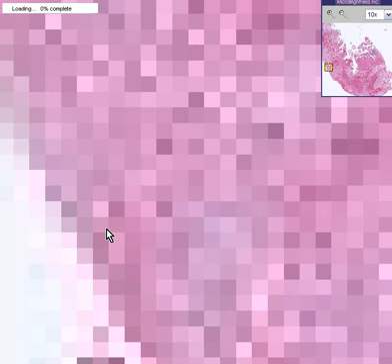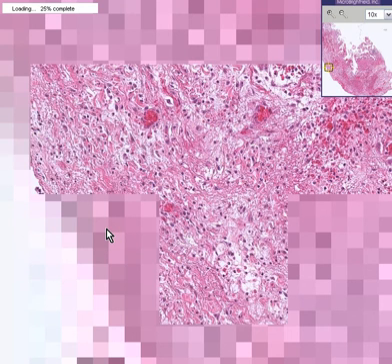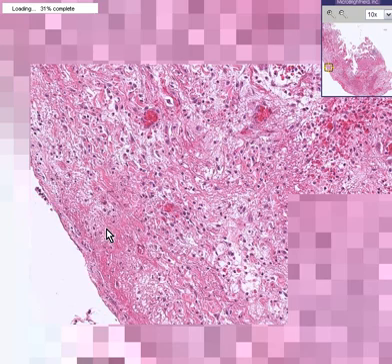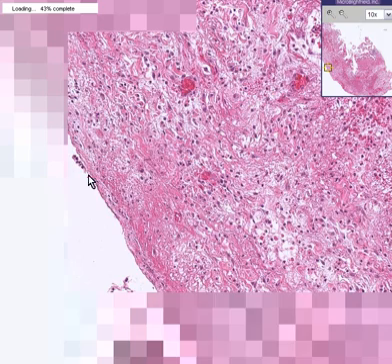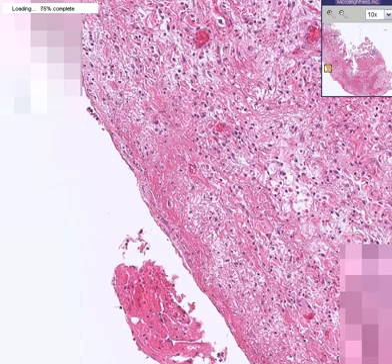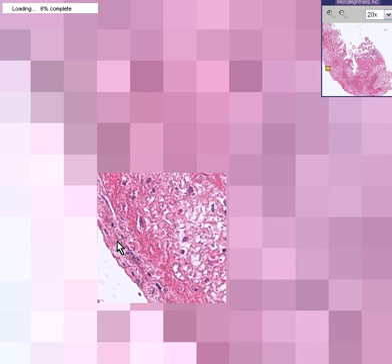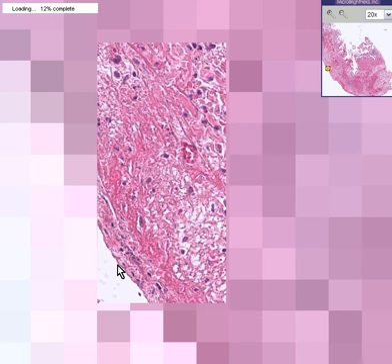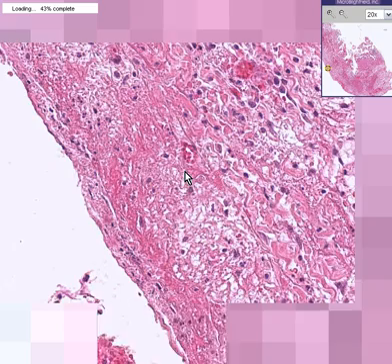This is a gallbladder which has the risk of rupturing because this inflammatory process is transmural. And because you see probably some flat mesothelial-like cells out here on the serosa, this could probably be a part of the gallbladder that was covered by serosa, rather than the part of the gallbladder that's kind of tucked against the fossa of the liver.